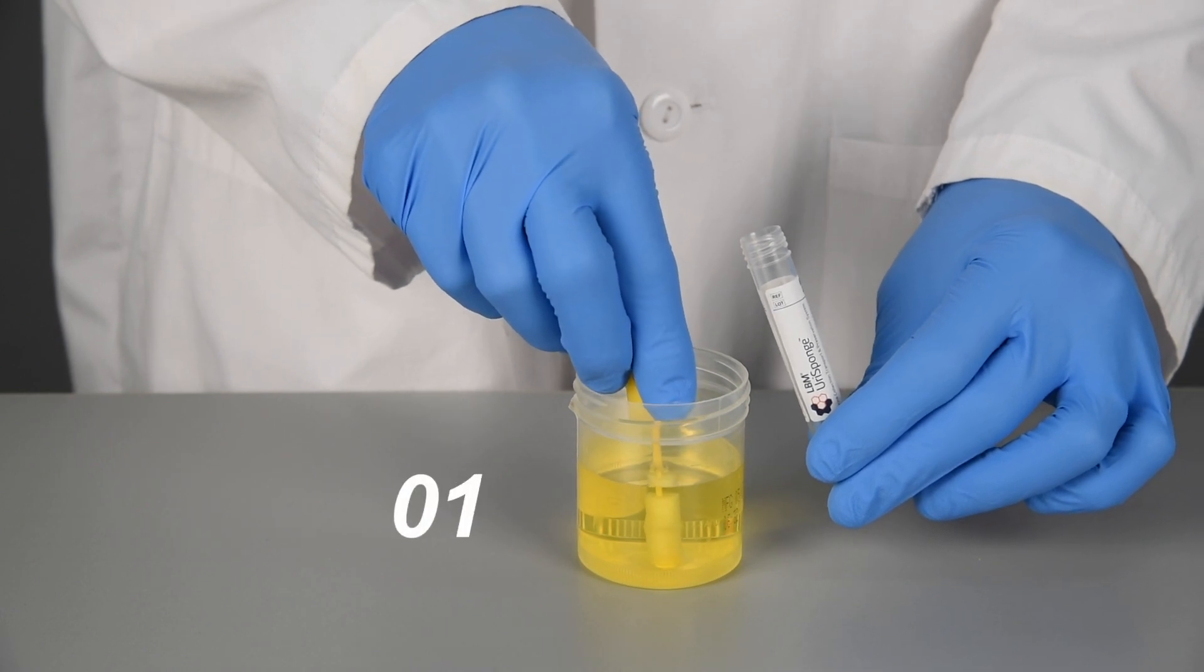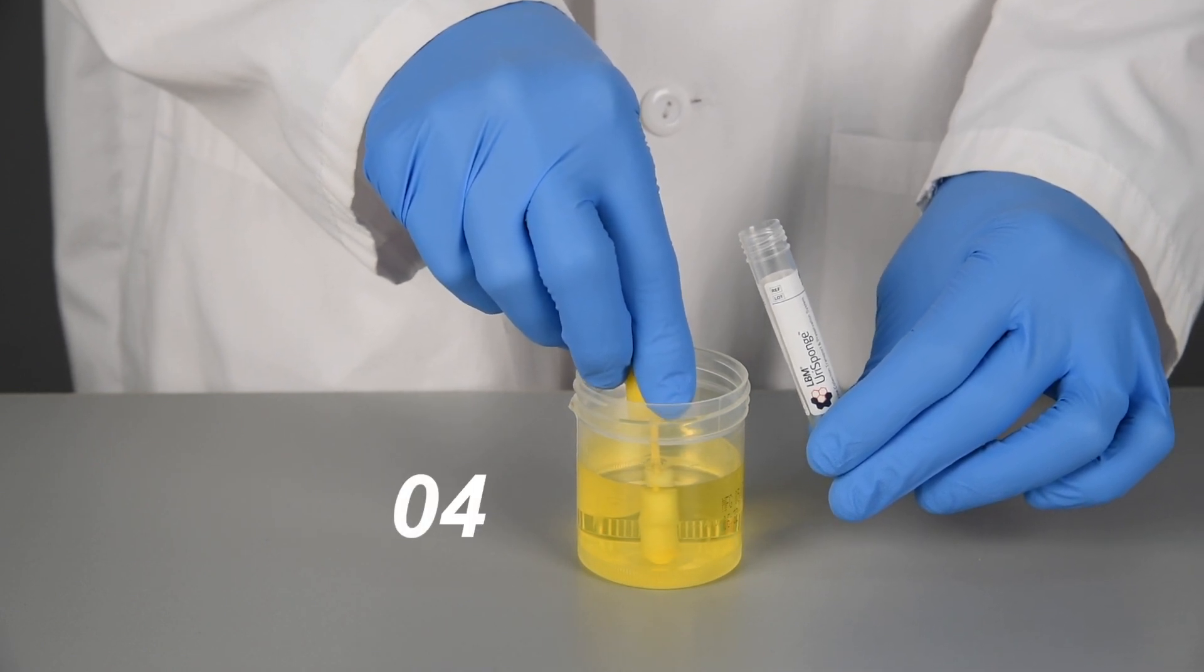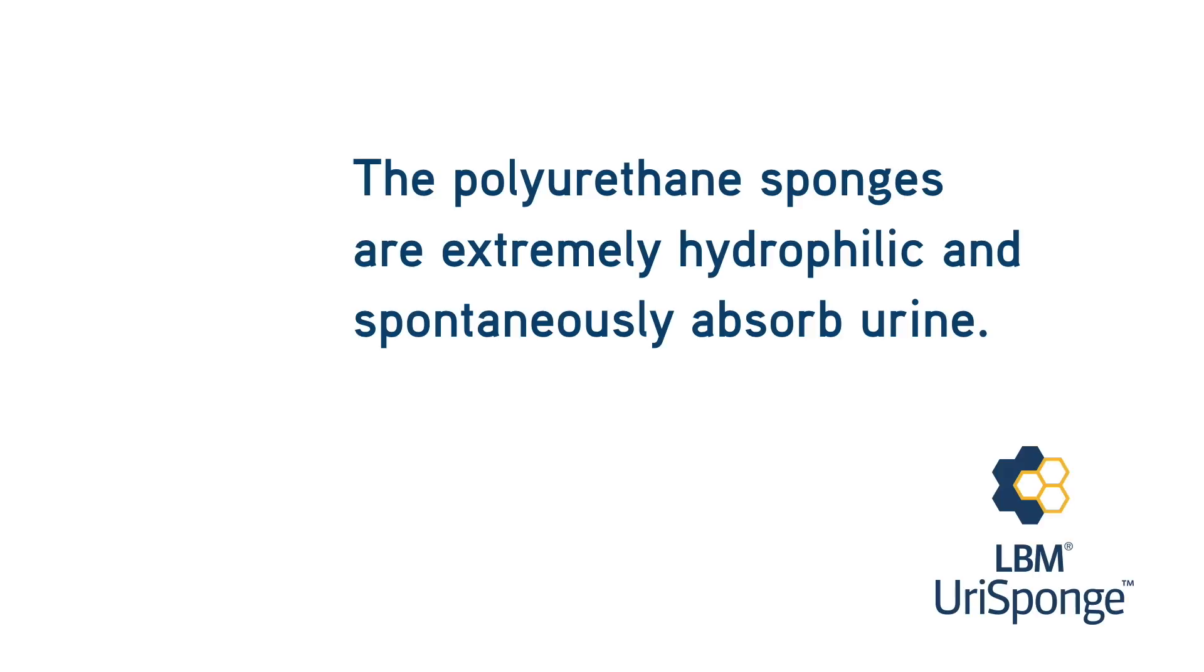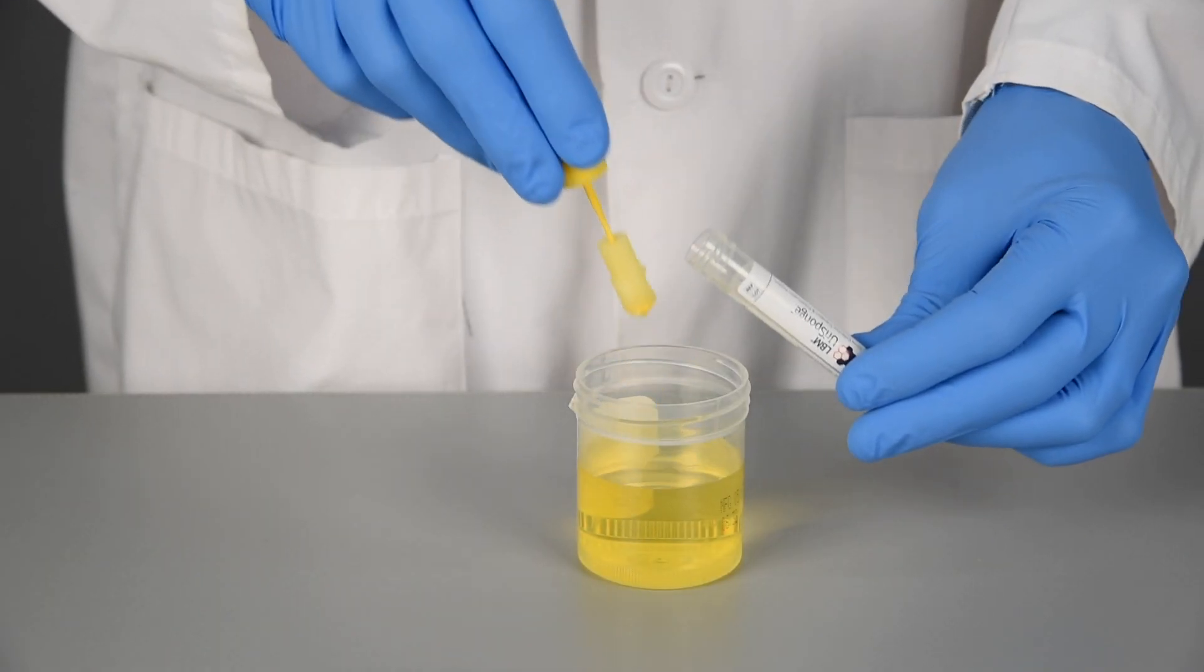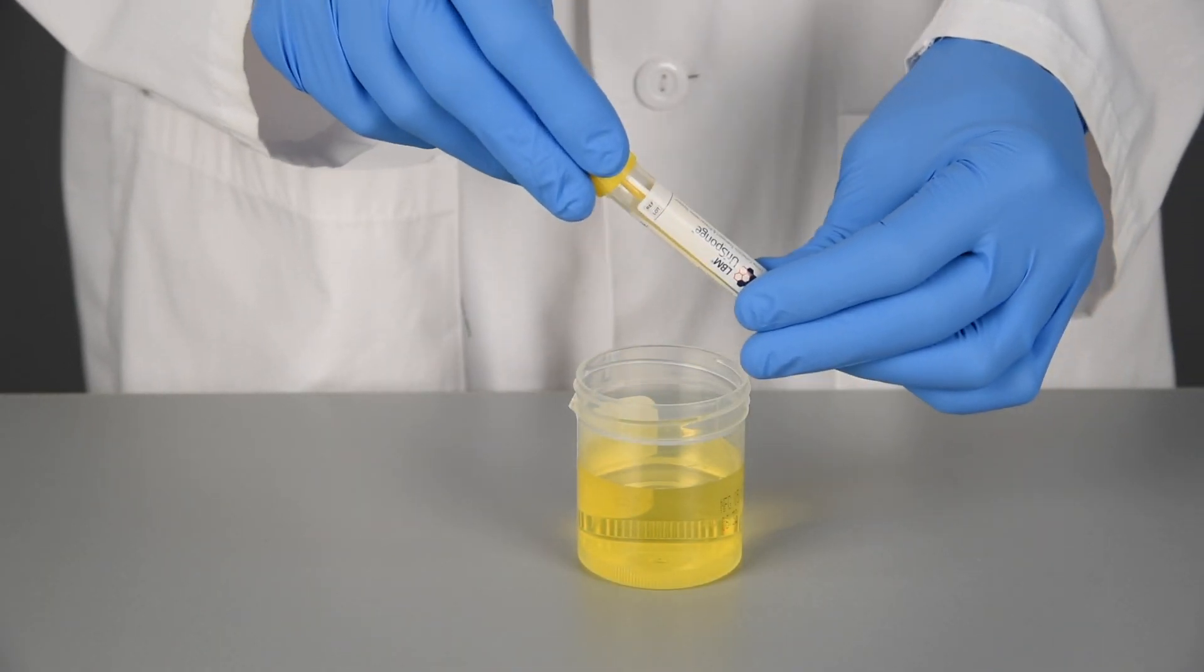Submerge the sponges for five seconds. The polyurethane sponges are extremely hydrophilic and spontaneously absorb urine. Remove the sponge applicator from the urine sample and return it to the UriSponge tube. Do not add urine to the tube other than the urine spontaneously absorbed by the sponge.